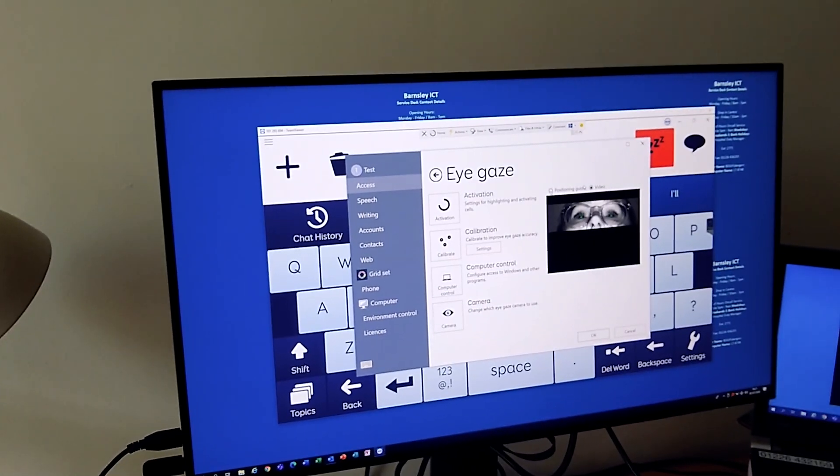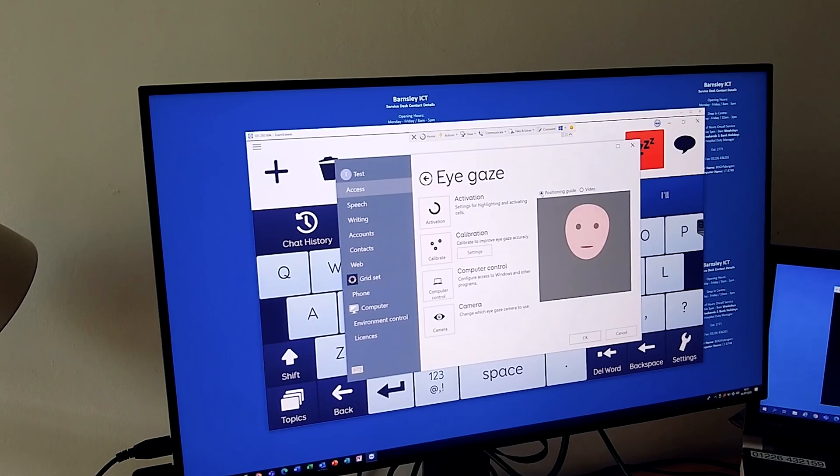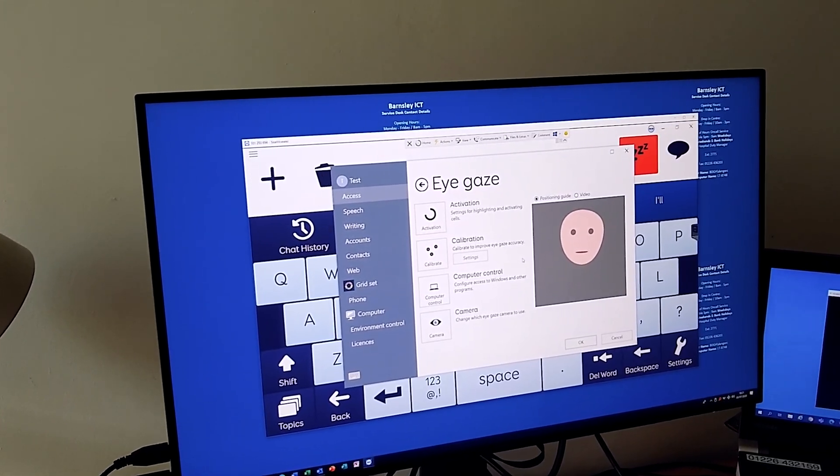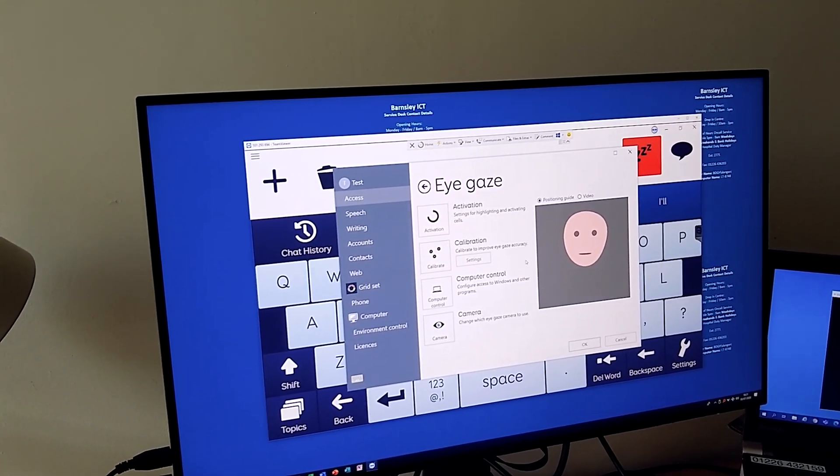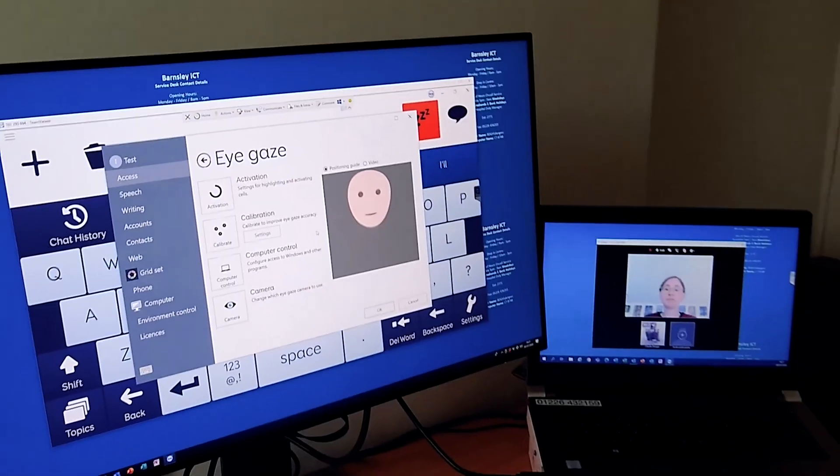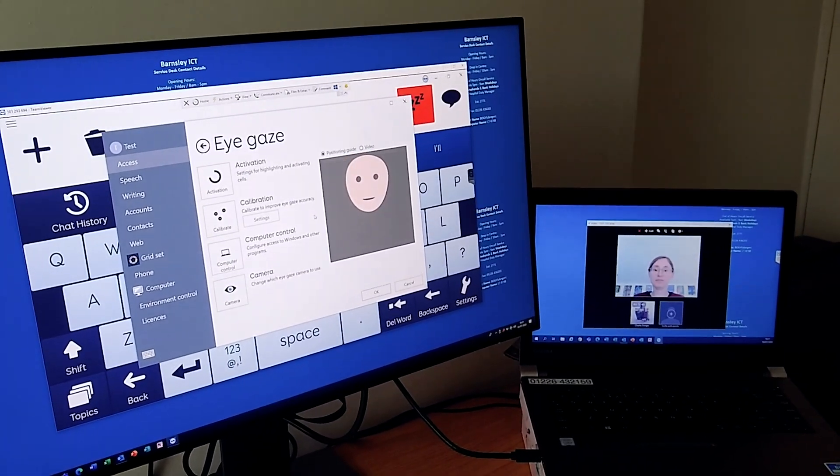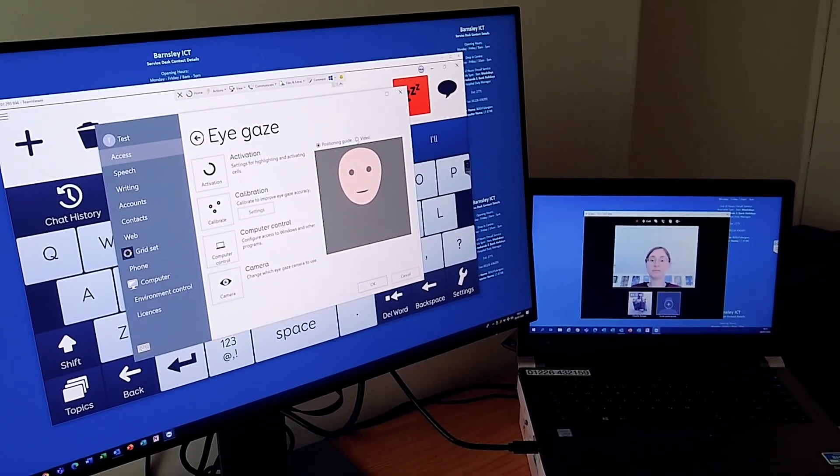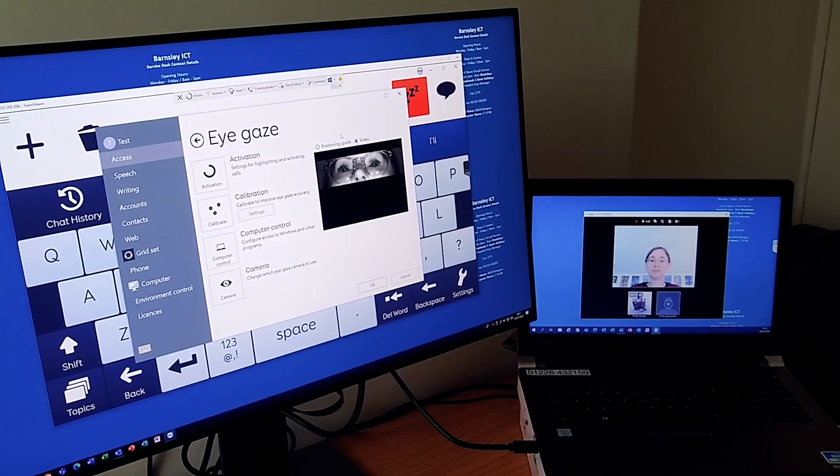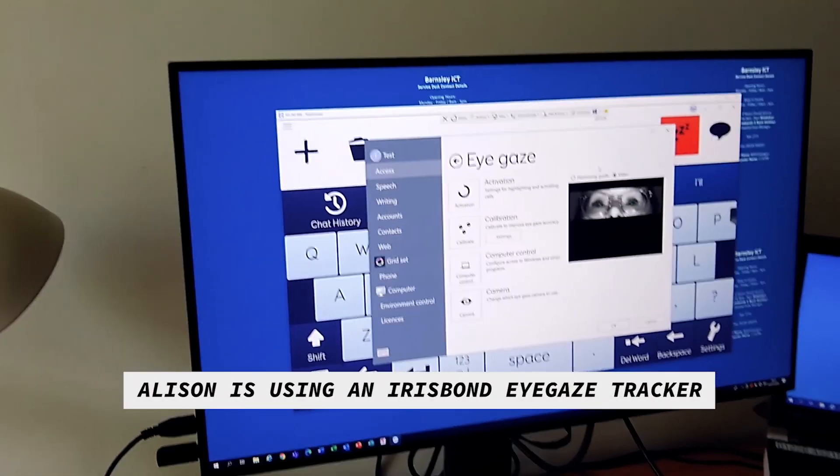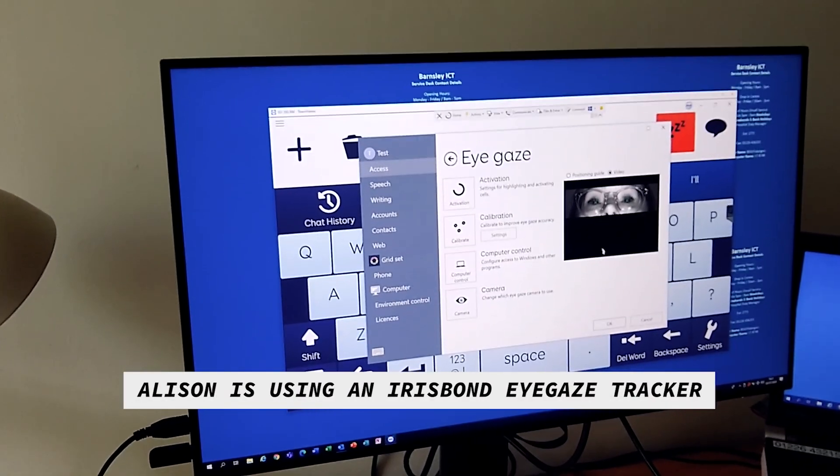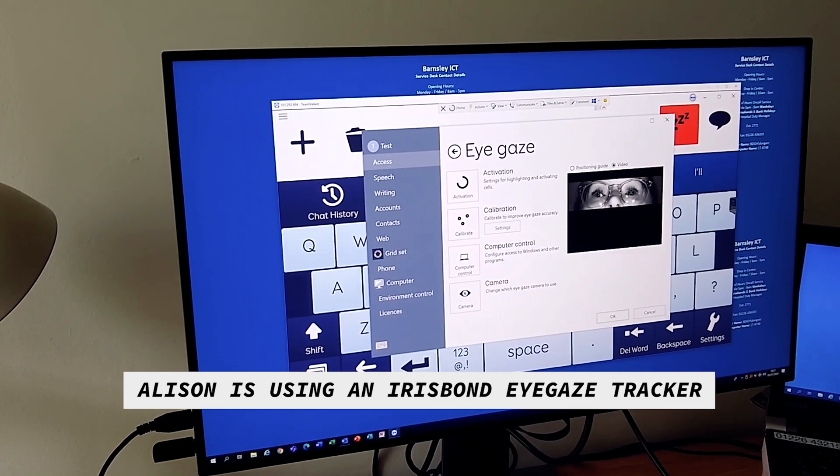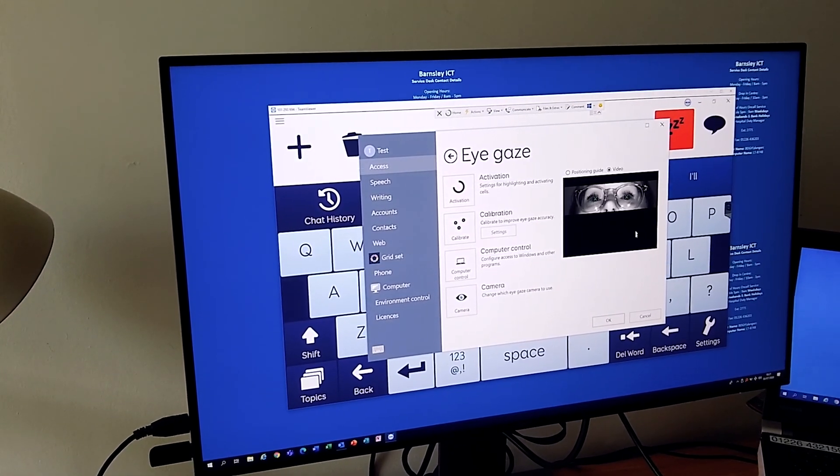Before I went to the video, if I go back to the positioning guide, I noticed that Alison's probably a little bit far back. So if I could ask you just to come forward a little bit, and then I'll have a look at the video. Yeah, I think that's better.